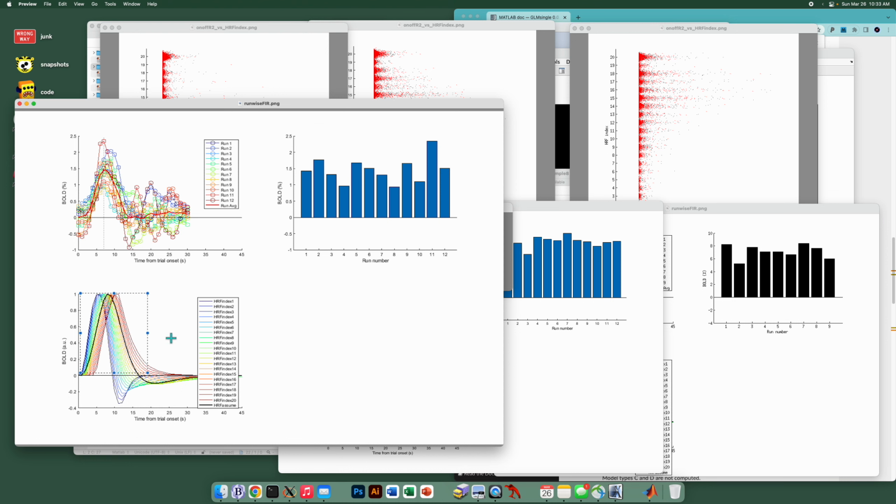Notice there's a one-to-one correspondence in the x-axis across this plot and this plot. So the library is shown in the rainbow colors, and we have the HRF assumed one shown in black. So this assumed one is used as a very initial step, for example, for the on-off model. And again, it's here to help us diagnose any potential strangenesses that might be going on. Okay, so given this plot, we can observe many things.